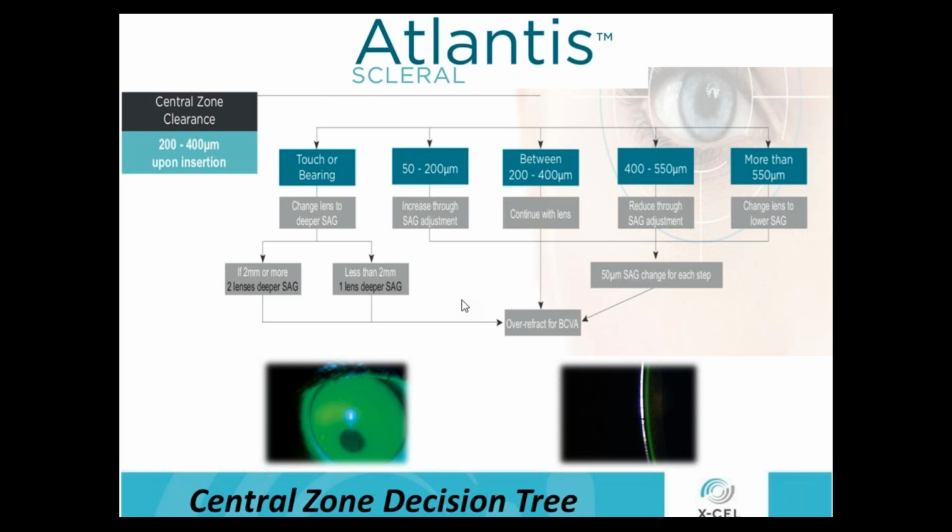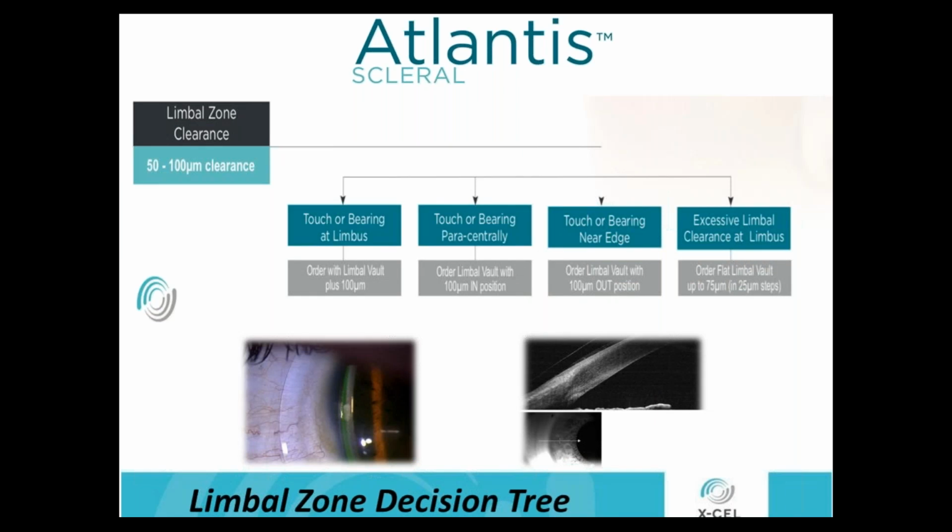And that's the way our design works, the Atlantis design. And then another way is through the edge. So some designs, you can manipulate that sag and increase or decrease it by steepening or flattening the edge. So if you steepen the edge, you actually increase your central sag. Important to know what design you're using and what options you have and how they work when you're making changes.